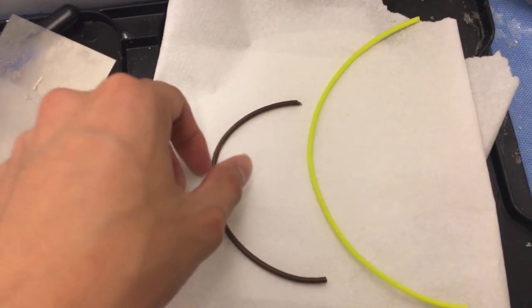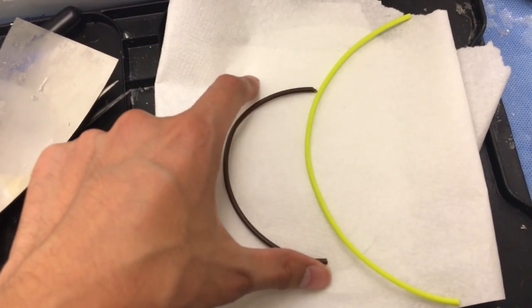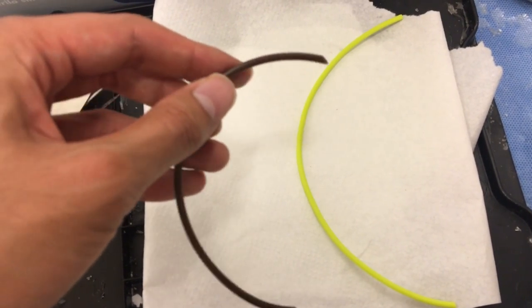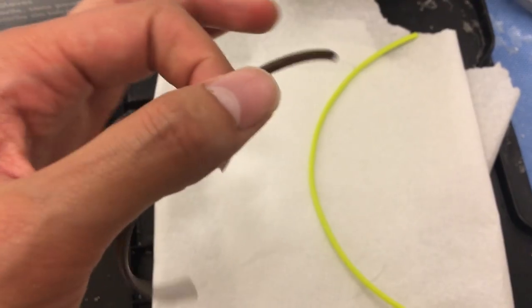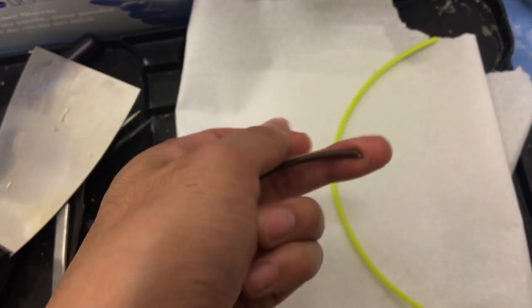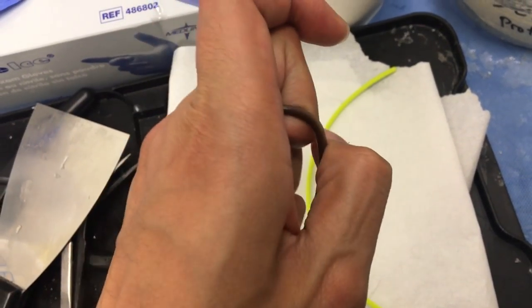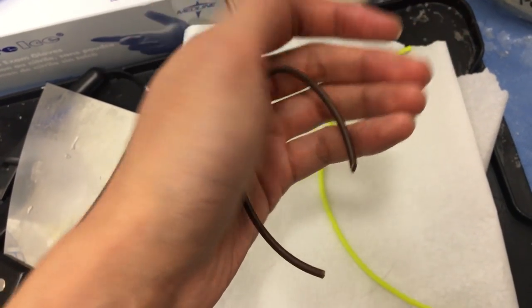Alright, this is the example of two different kinds of filament. On this side is a thermoplastic that's just commonly found in all fused deposition model 3D printers. This particular one here is brown PLA, or polylactic acid. So like the majority of thermoplastics, it's just a rigid plastic. And if I were to bend this, it just retains its shape.